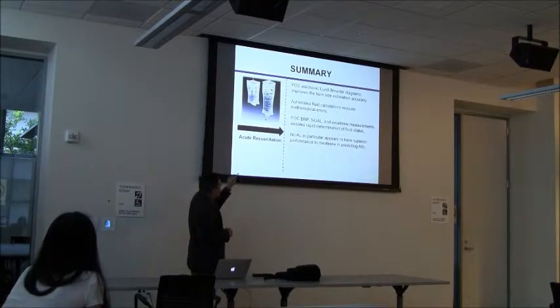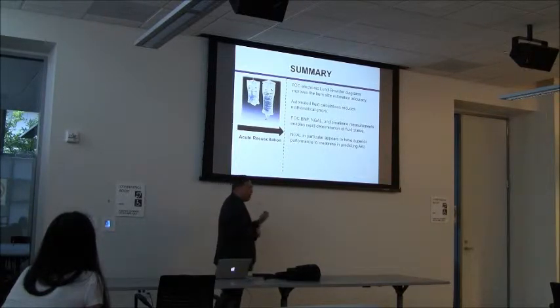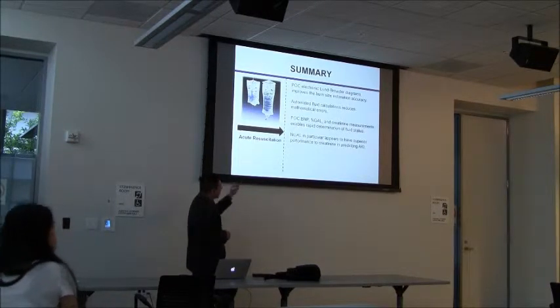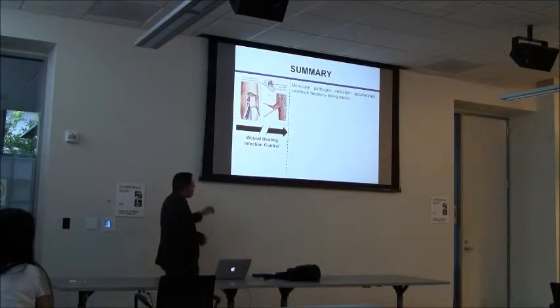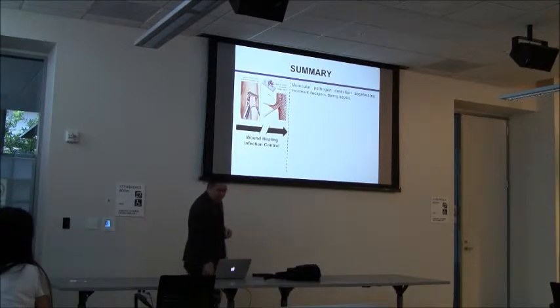And then, of course, these point-of-care biomarkers for BNP, NGAL, and creatinine help us determine how well a person is getting fluids and also detect acute kidney injury quite early. Okay? In terms of molecular pathogen detection, we kind of know this now, we're in the world of molecular testing. It does accelerate treatment decisions, especially during sepsis.